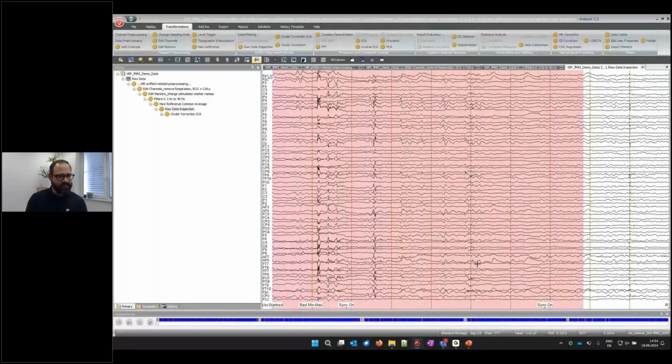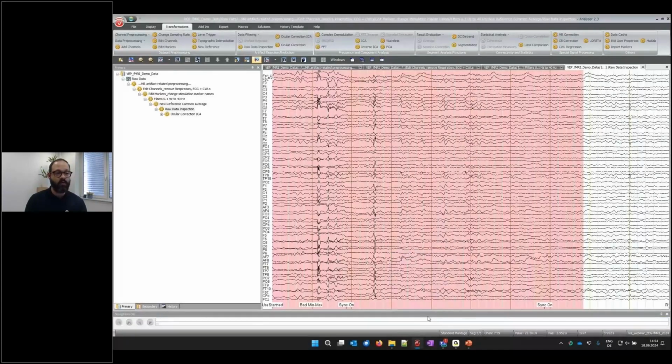You cannot really see them down here in the navigation bar because, again, those scanner markers overshadow everything, but I show you a little trick. You can right-click here and deselect all marker types, and then I select only the bad intervals, and now you see where they are. So you can now jump to them and review them again.